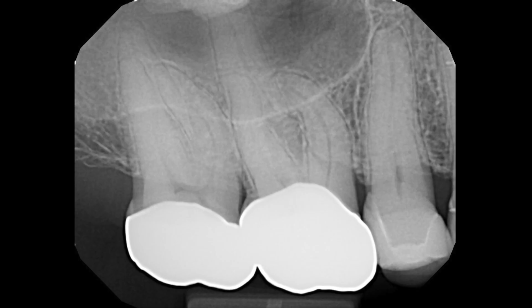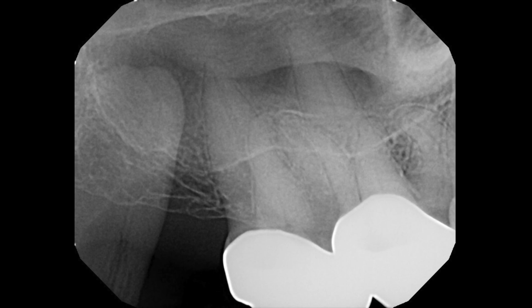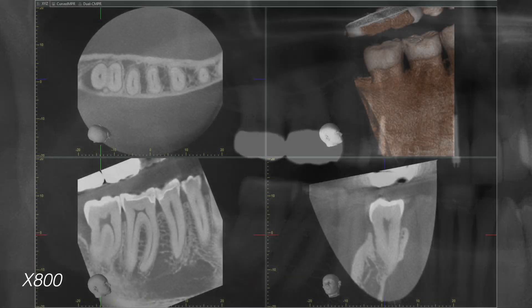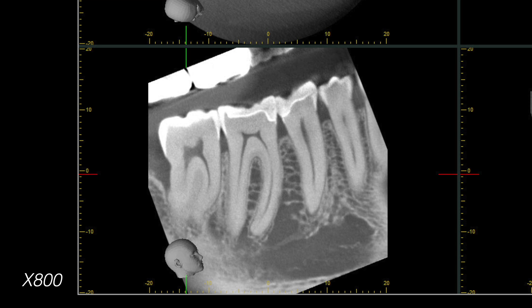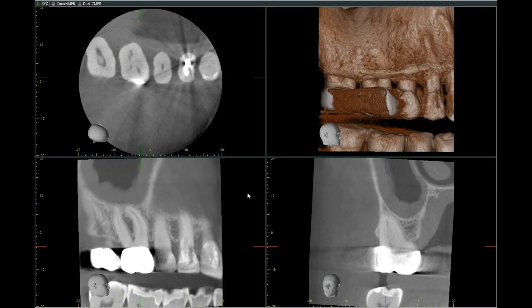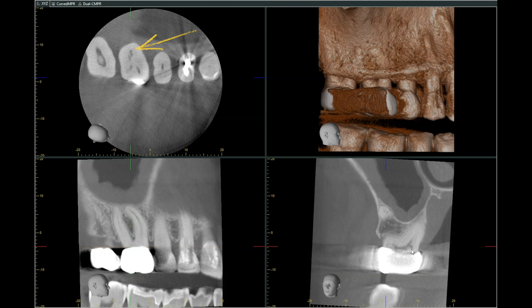Here we have a maxillary first molar with a recent crown. This patient came in with diffuse pain on the right side of the face without any specific site of localization. We took a CBCT bite-wing of the max and mandible. On the panoramic we see crowns on the maxillary and mandibular teeth, some large fillings, and a deep cratering lesion on the distal of the mandibular second molar. However, after vitality testing, the primary source of the problem was identified as the maxillary first molar.